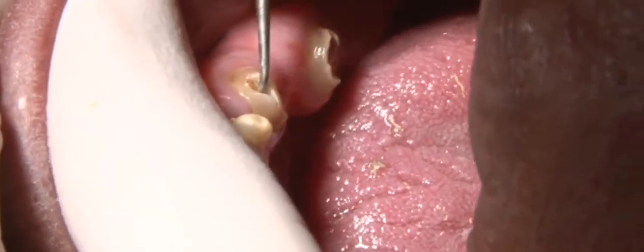As I previously said, we have to be very meticulous in removing the gutta percha from the canal as well as the coronal part of the tooth.